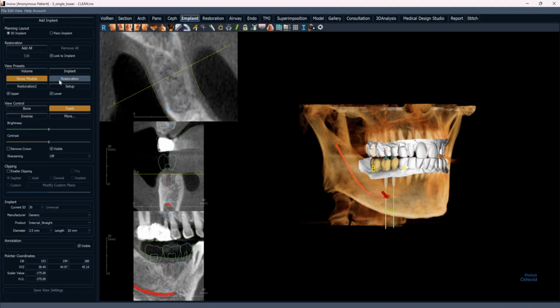And these can be set up across different locations if we are working with lots of workstations and lots of locations following the same type of protocols and workflows when it comes to those planning procedures.